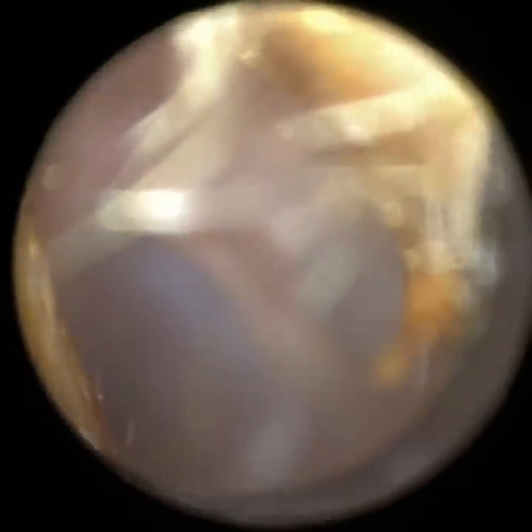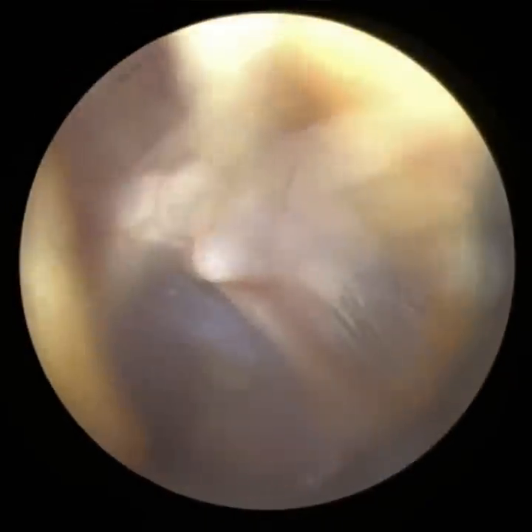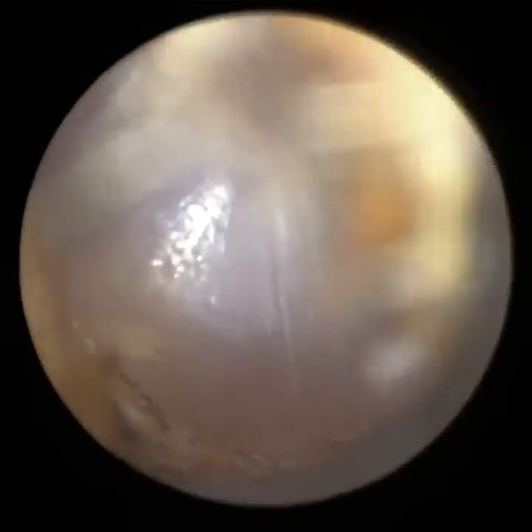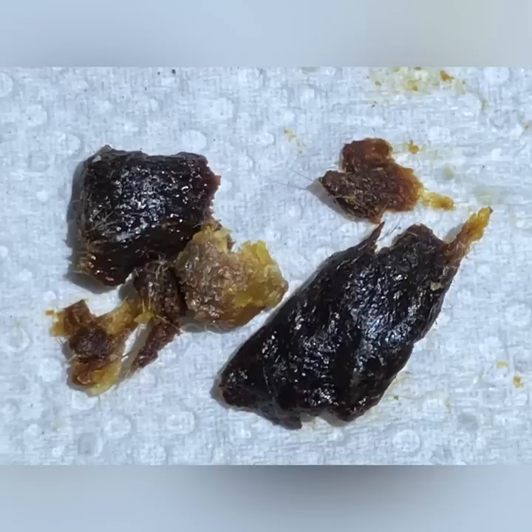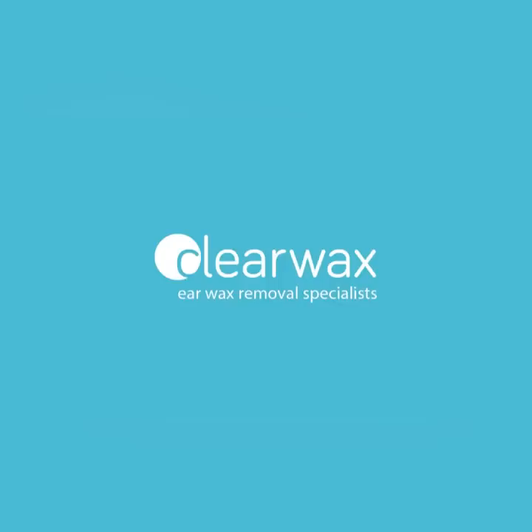Ideally, the smaller speculum would have been better just to dilate this ear back — I can still see the eardrum. That's the malleus handle. I'm going to get the pars tensa in focus, and again, not only the oblique ones, you can see the radial fibrous connective tissue. That's the wax that I removed — you can see it's quite dark, it's oxidized, it's been there for a while, and you can see the dead keratin in between the two dark plugs. I hope you enjoyed that video, guys. If you are interested in the WaxCope, please do email info at clearwax.co.uk. Thank you. Bye.